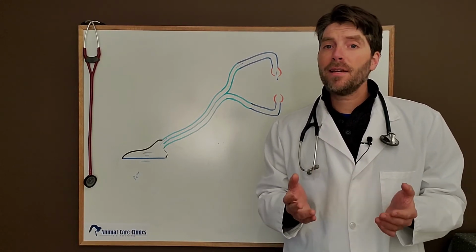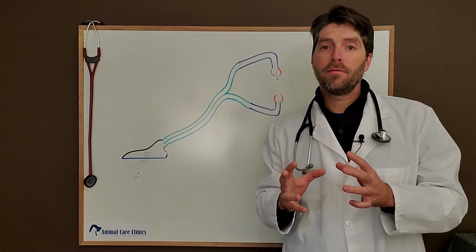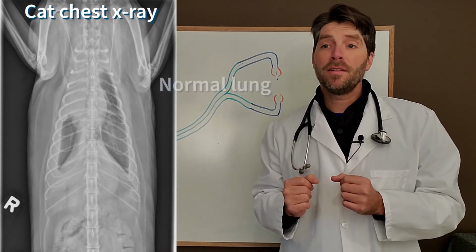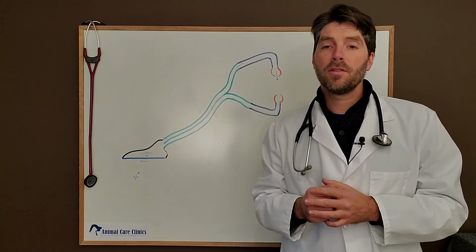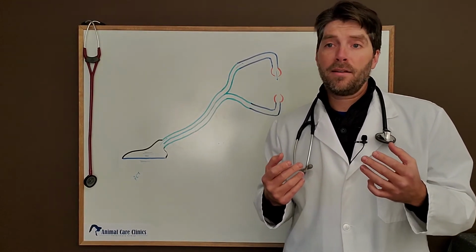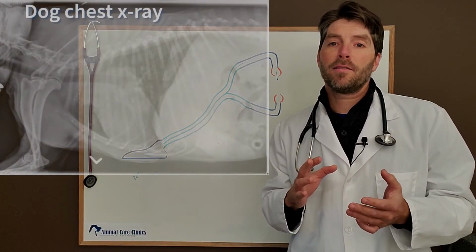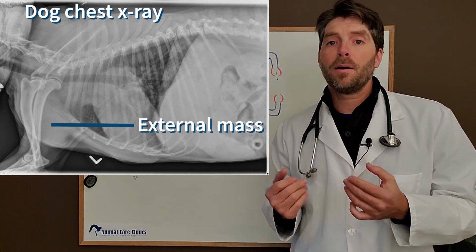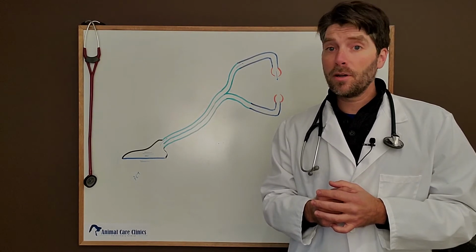If we can't hear lung sounds at all, that can indicate that the lungs have gone solid, either they're full of something like bacteria or full of some other disease, and that's called a consolidation, and that's not great because now no oxygen is getting through the lung in that area. The other thing that can happen is we can have something between the lungs and the stethoscope, a mass or something like that on the outside of the lungs, which will also stop the lung sounds from coming through. Again, both good reasons to have a look and see what's going on.